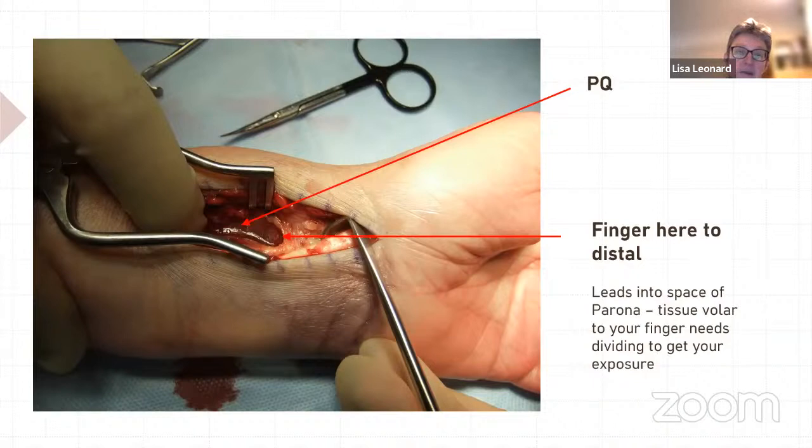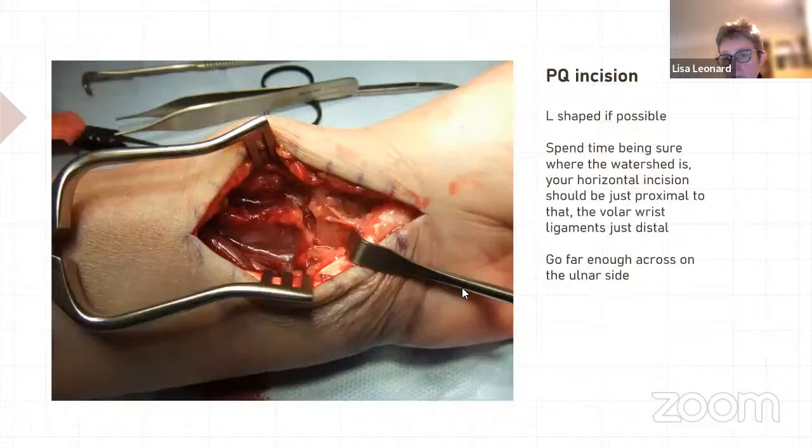You're not damaging the ligaments at that point. There's often some little arterial branches there that you need to watch out for. So pop your finger under there and make sure you free up as much as you can to get your view distally. Now, in this case, it's a bit too distal and not proximal enough, but it has got an absolutely brilliant view of the ulnar side of the distal radius.